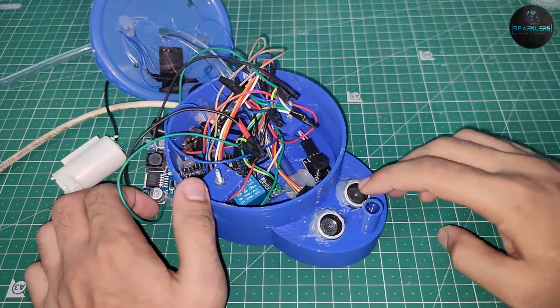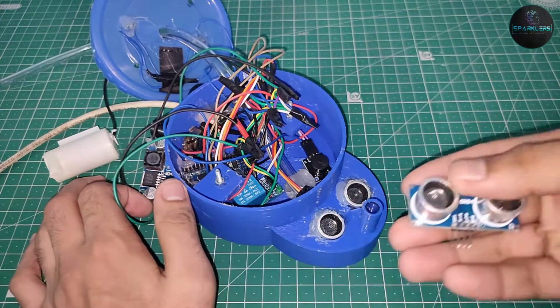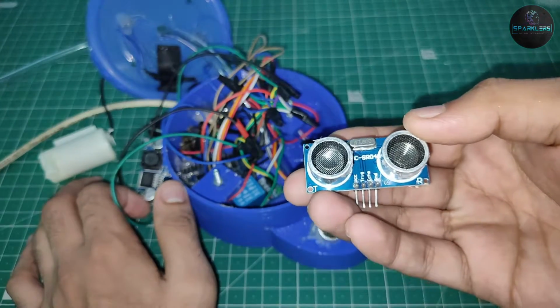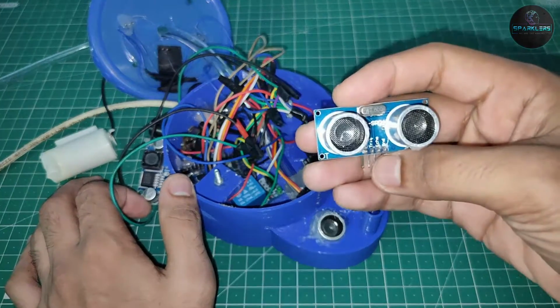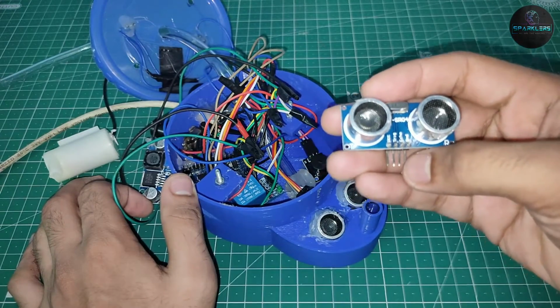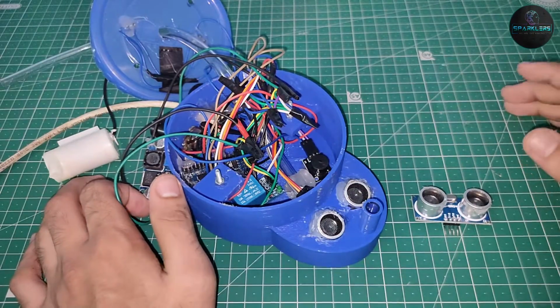So at first, here is the ultrasonic sensor I have connected. Now if you know how an ultrasonic sensor looks, this is how it looks. There are 4 pins: VCC, trigger, echo, and ground. So connect the VCC pin with 5 volts, connect the ground pin with ground, and the trigger and echo you can connect with any pin in Arduino.